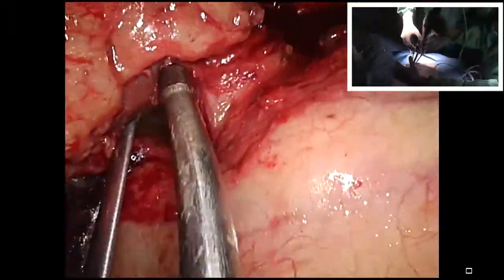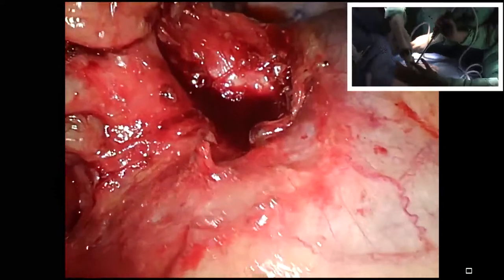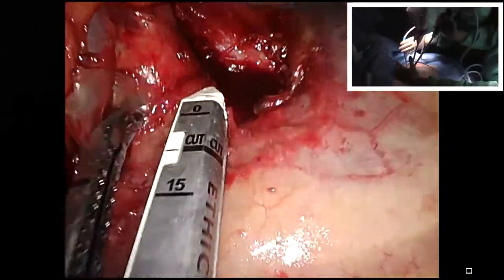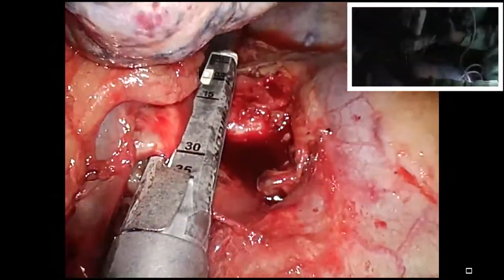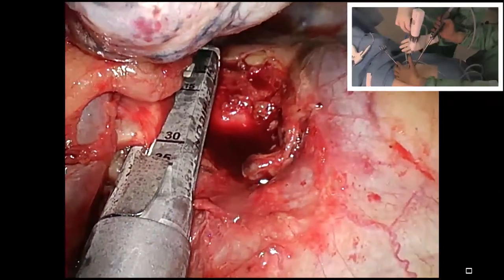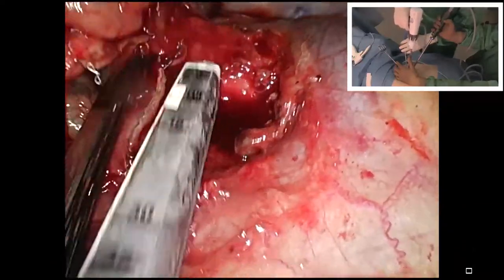So the main artery is quite clear. So okay, stapler. We have now also the stapler, always with this angulation. Right upper lobe. Start with the, wait 10 seconds. That was the artery. Is this better, Jens? It's good. So Diego is waiting for the vessel also 10 seconds.